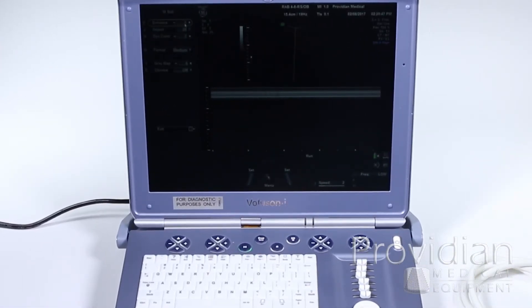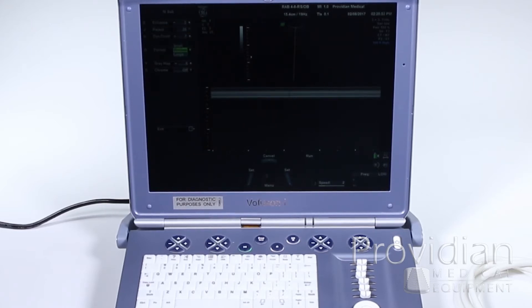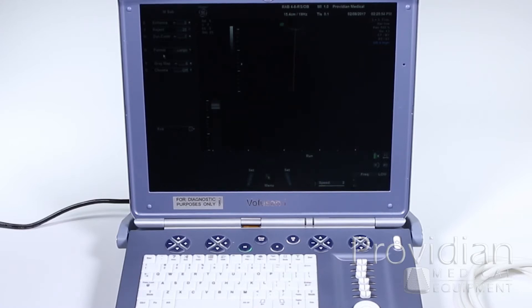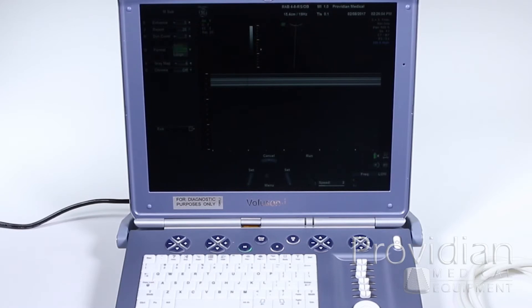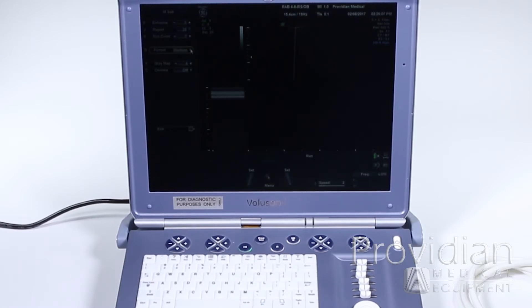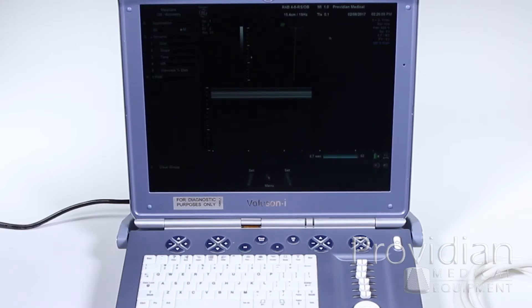In the sub menu, we have edge enhancement, B mode rejection, and dynamic range. Here you also have your format, and you can change the format to make the display larger or smaller. We'll go back to medium.